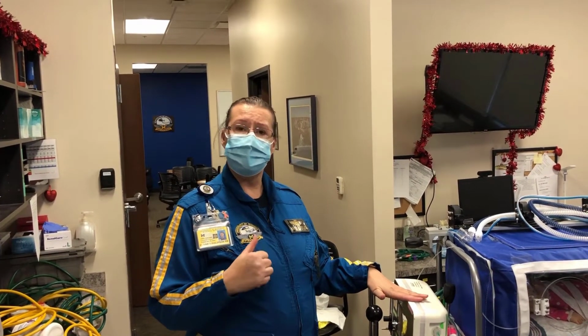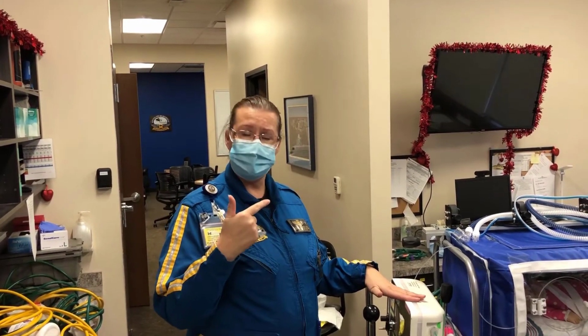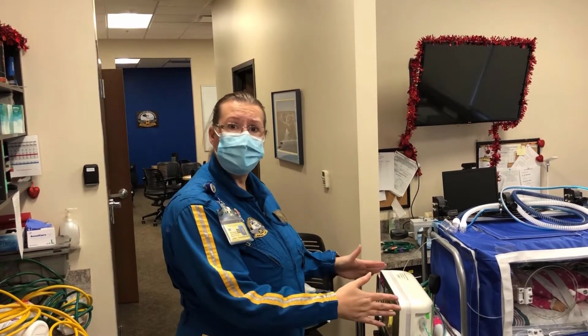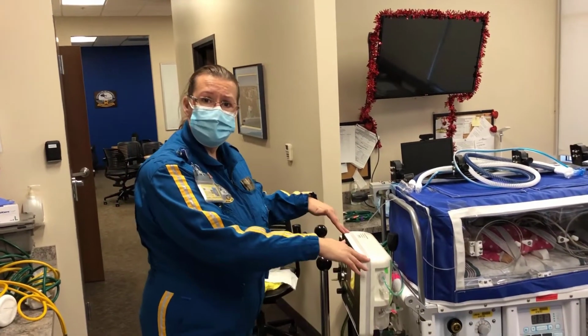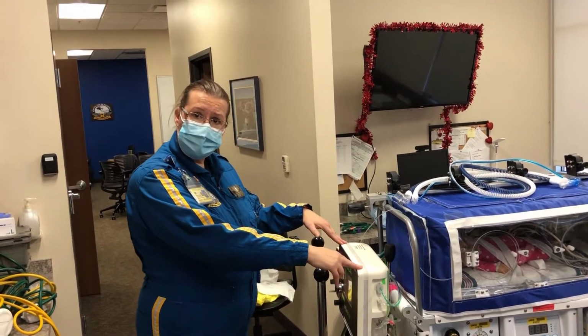Okay, so we get a call from Brandon and RT telling us that we're gonna go via fixed wing for a complex respiratory that needs possibly the jet, ventilator, and possibly nitric. So while Mod RT is gathering all of their equipment, the survival flight nurses need to start preparing the fixed wing Isolette. So first thing we're gonna do is install the Knox box.